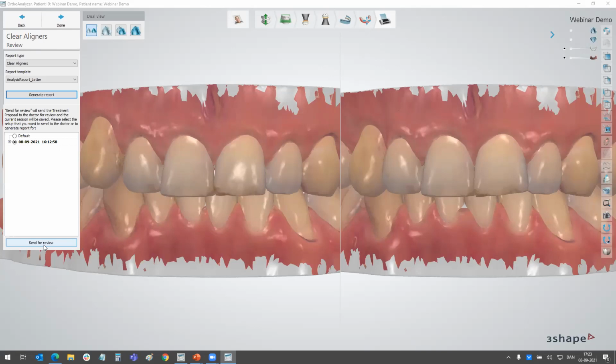And you can tell all your clients, potential clients, existing clients, that Clear Aligner Studio can grow with them. We already now support this, and this is something that they can dive into.